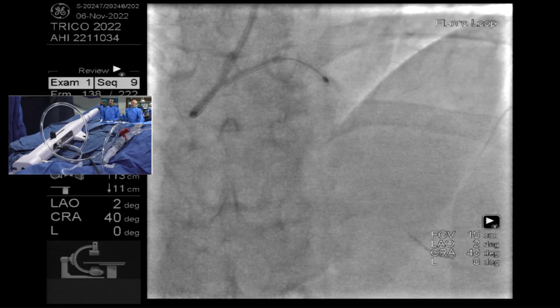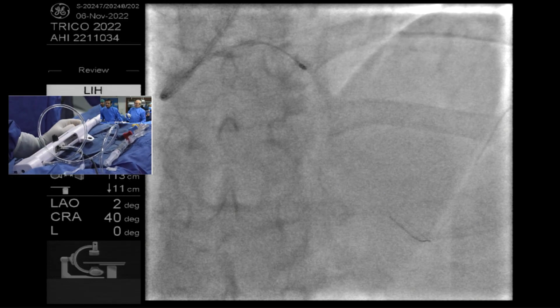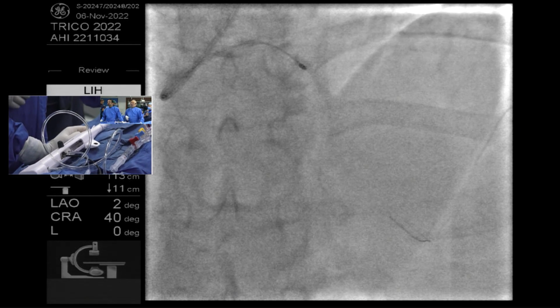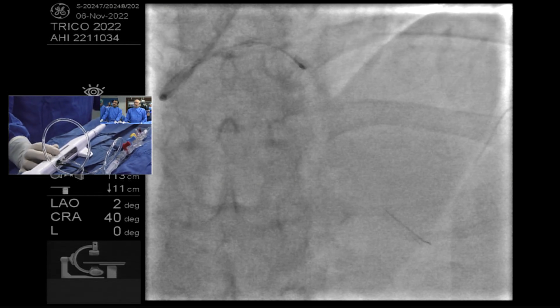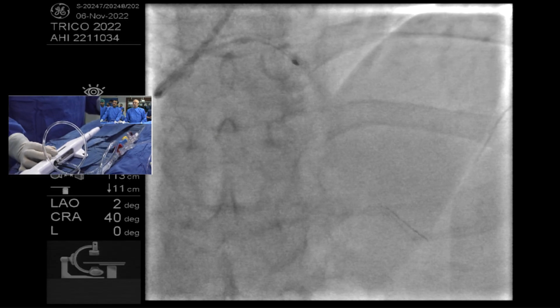How much do you wait in between? Again, people have different strategies. Samir, Tak and John, what is your strategy? How much do you wait between the two passes? A few seconds really. We think we wait longer, but if you have the timer on, it's not very long. So all of us have severe ADHD.